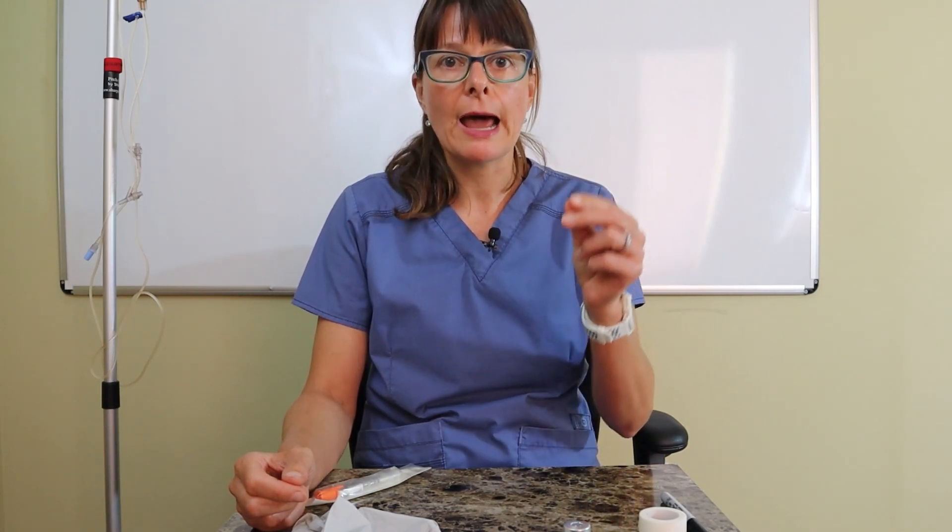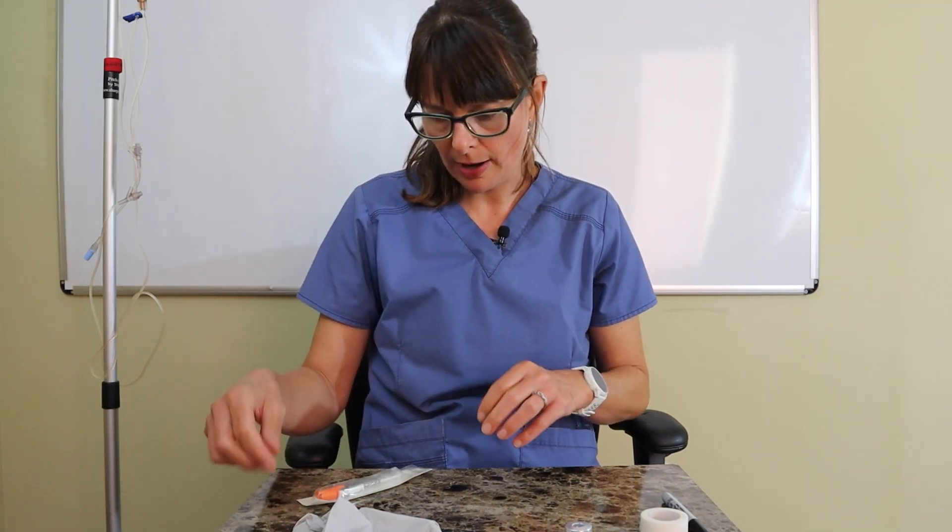For insulin we use specific insulin syringes, because insulin dosages or units of insulin are very small amounts. We need a specific syringe that will allow us to visualize the amount of insulin that we're going to draw up.